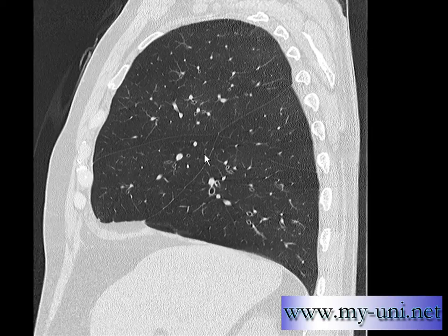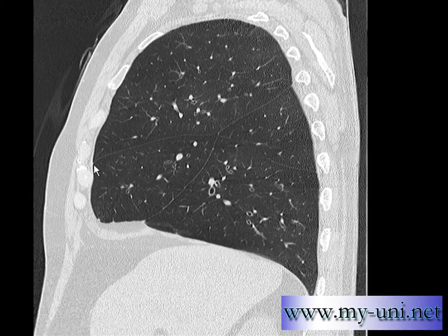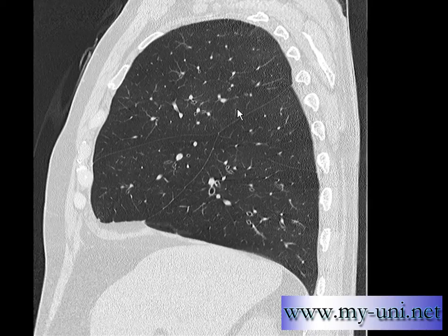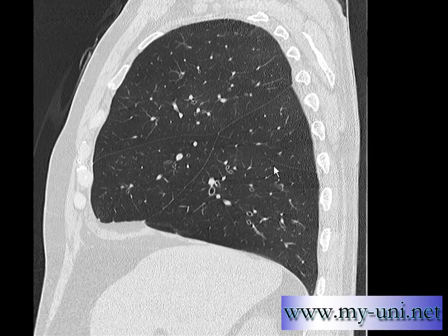This is the right lung — it has an oblique fissure and a horizontal fissure. So this is the right upper lobe, this is the right middle lobe. Always remember: the right middle lobe is anterior. This is the right lower lobe, which is posterior. Its superior aspect is adjacent to the right upper lobe, and anteriorly it has the right middle lobe.